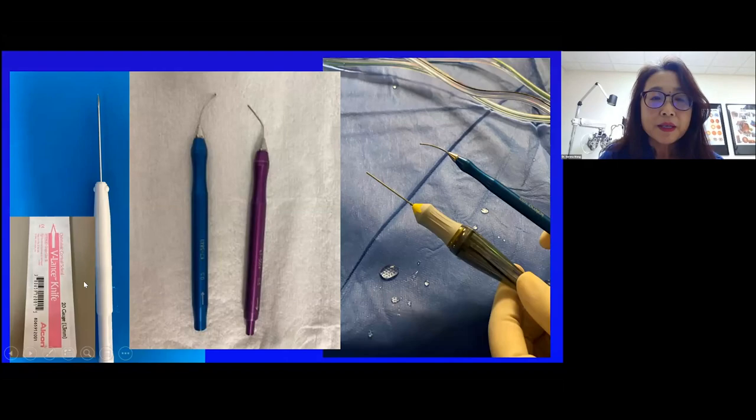Sometimes I also do bimanual procedures, when I don't put in an artificial lens. You can do bimanual even with a lens, you just have a larger incision. This is what I use. I like to use 20 gauge. Obviously you can do 23 and 25 gauge. I tried all of them, but they're not as efficient. Those 20 gauge are so efficient, they get the cortex out so much faster.